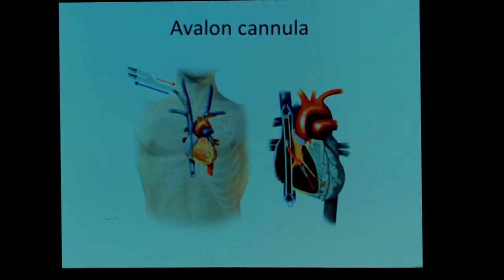And then the other thing is you should see the outflow opening, which is going to be in this area, with the jet directed toward the tricuspid valve, toward the RV. If it's in the other direction, then the cannula needs rotation. Just rotation. Usually the surgeon will ask you, is it pushing, pulling, or is it rotation, or is it both? So you have to decide.